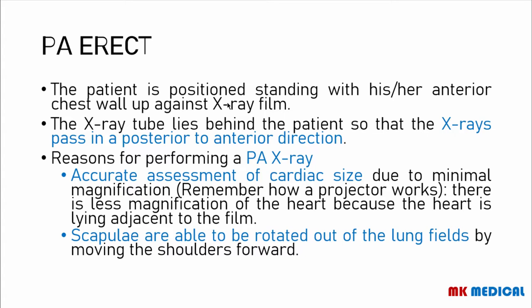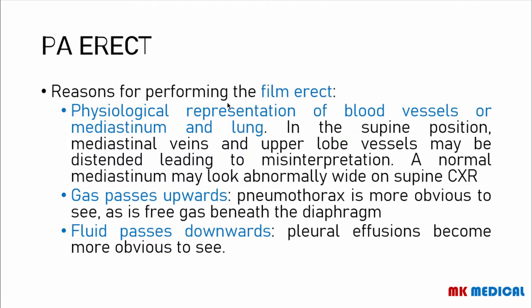The other reason why we can order a posterior anterior chest x-ray is because you can rotate the scapula in a special way and remove them out of the lung fields. Because if the scapula are on the lung field, sometimes they may be confused for some pulmonary pathologies.